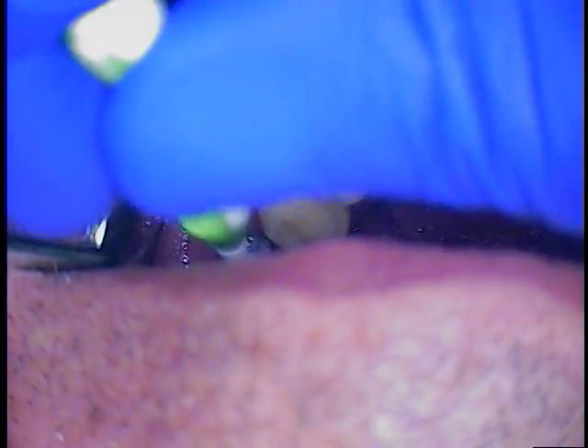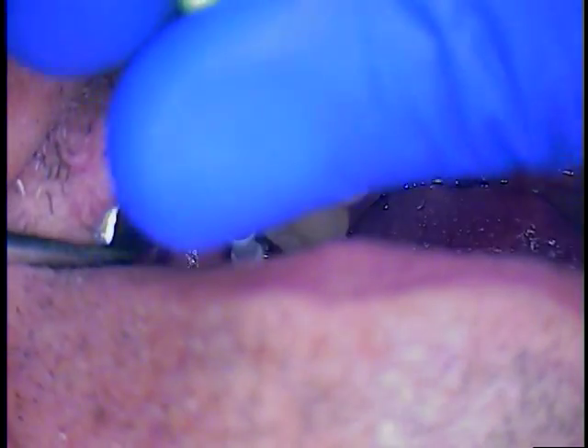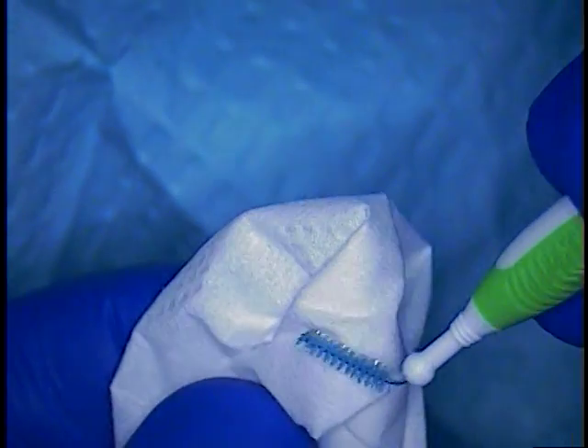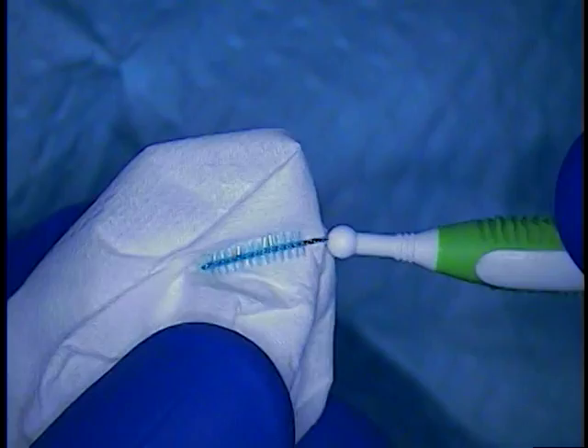I can't express enough how important it is to get the threads clean. So you take a little pipe cleaner — we call these go-betweens — and you fill that first with the soap medium. Then you actually use tissue and blot it to see if any metal filings or bio-burden are in there.